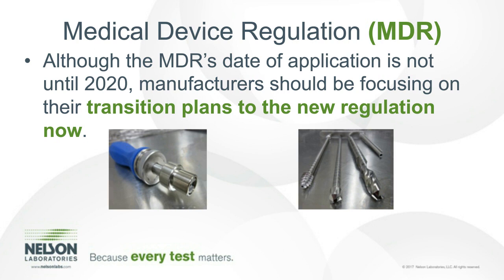There is a lot of information regarding that in MDR Article 5 if you have access to the document. They also give you a transition phase: if you can't meet 2020, you have till 2024 to focus on how to get your devices CE marked for European regulations.